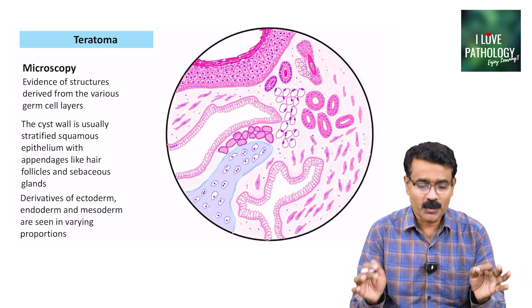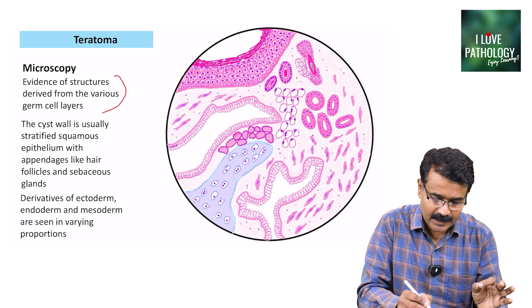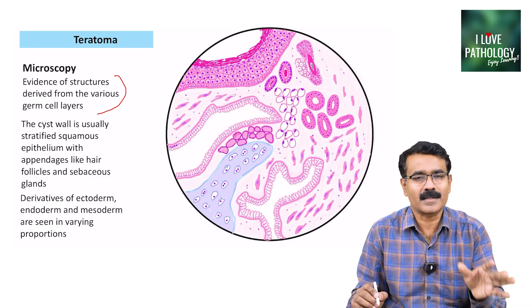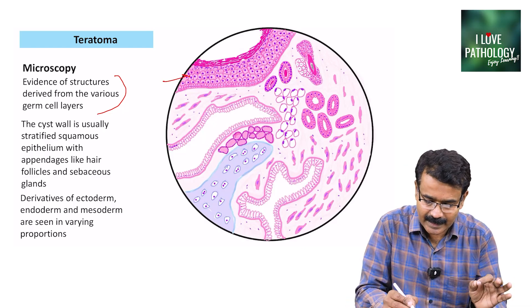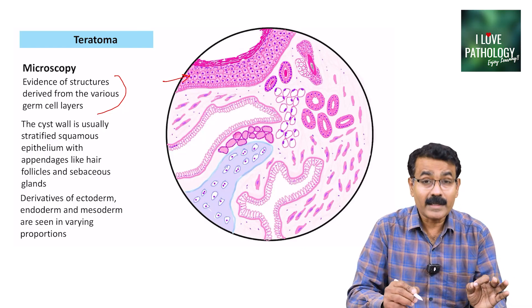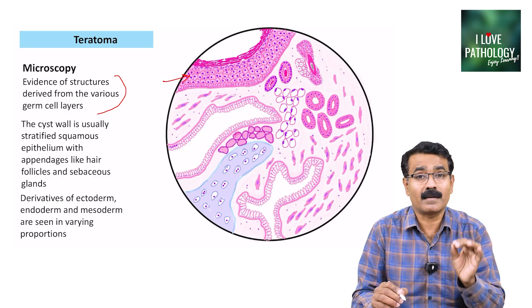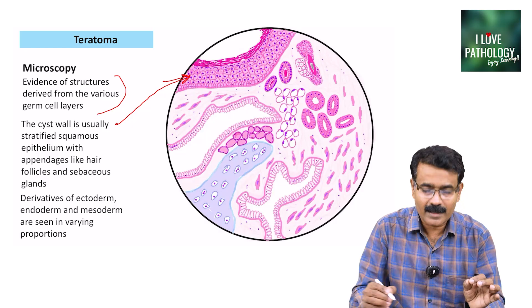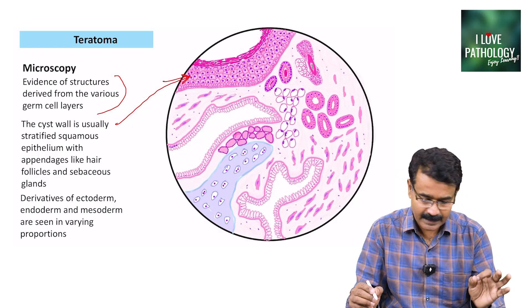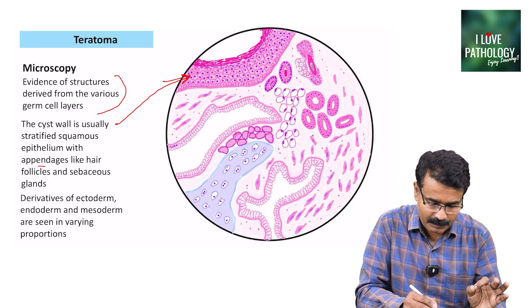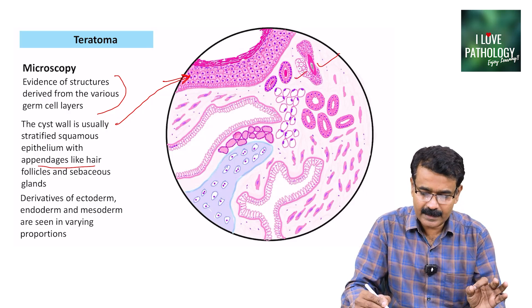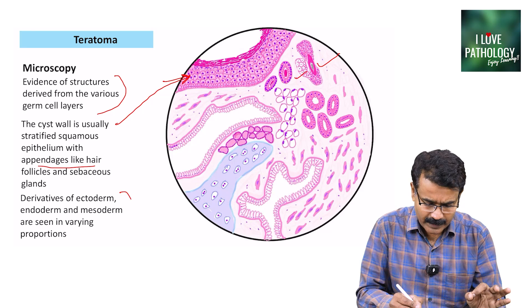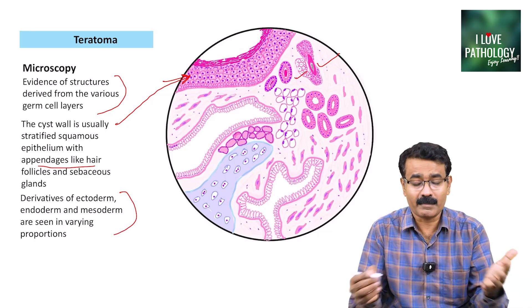Microscopically, you need to observe evidence of structures derived from the germ cell layers. The most common structure you can see is the skin and its adnexa. In a benign cystic or mature cystic teratoma, you will find the cyst wall usually lined by stratified squamous epithelium, along with appendages like hair follicles and sebaceous units. You can also find derivatives of ectoderm, endoderm, and mesoderm in varying proportions.